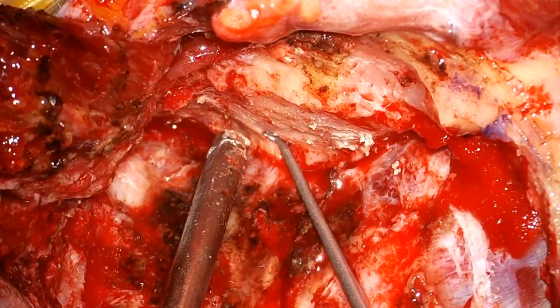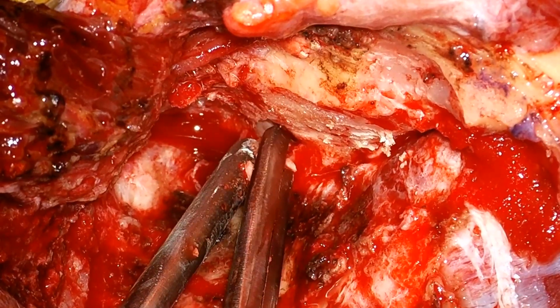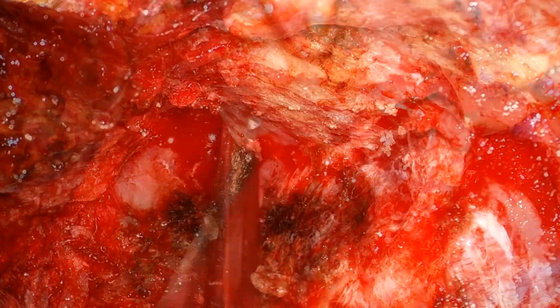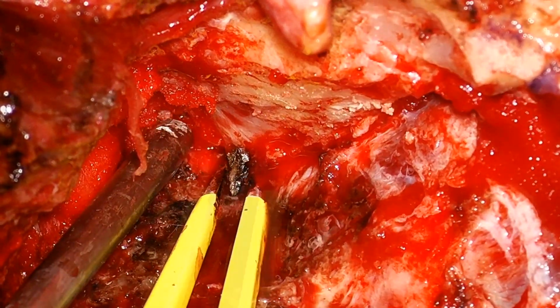In sphenoid wing meningiomas, I personally prefer to perform a small lateral orbitotomy, like in this case. This is important not only to treat the retro-orbital pain in patients with tumors of this kind, but it's also helpful to find the meningo-orbital band at the level of the superior orbital fissure.